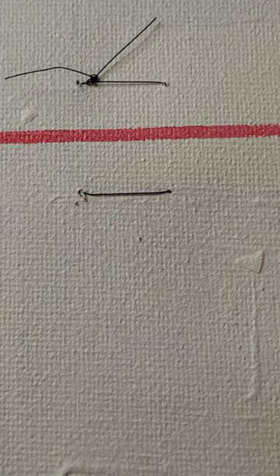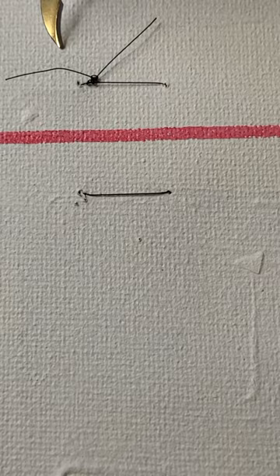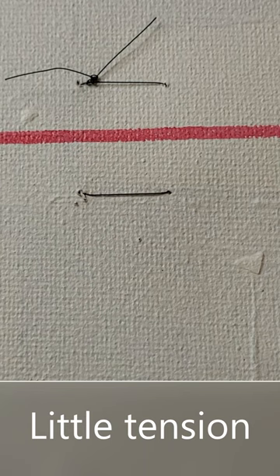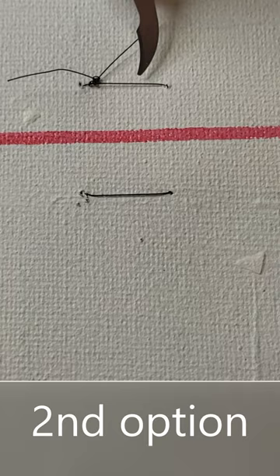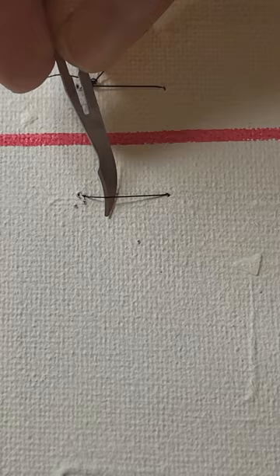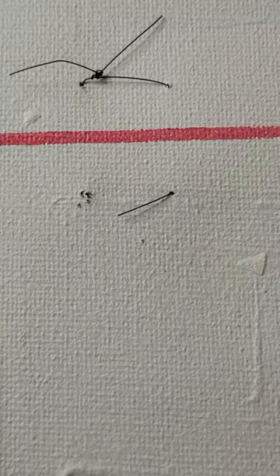This is a horizontal mattress suture. It's a very nifty type of suture because it runs along the wound on both sides and holds the wound together nicely without putting too much pressure on the wound edges. You have two options: go under this side or this side of the stitch. You pull up and remove the stitch with forceps — very simple. You've removed two stitches for the price of one.